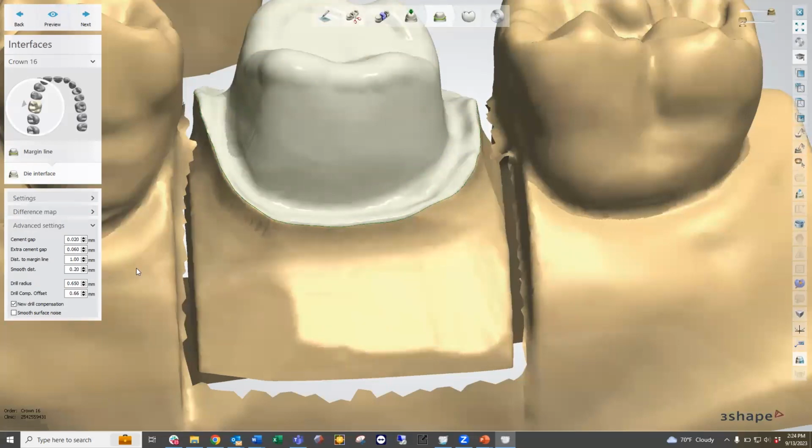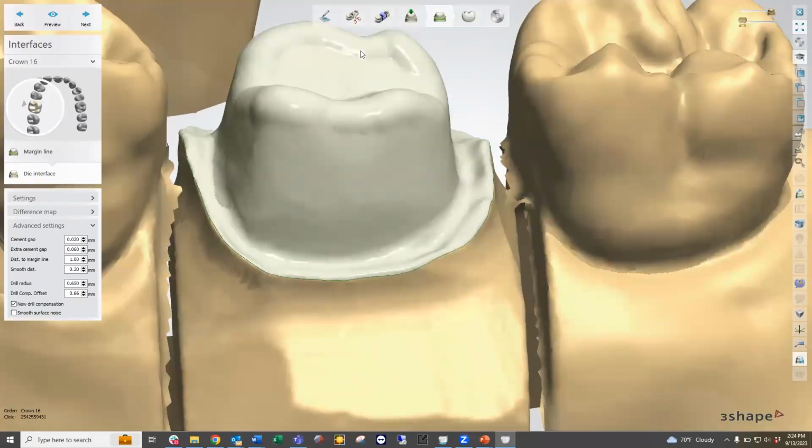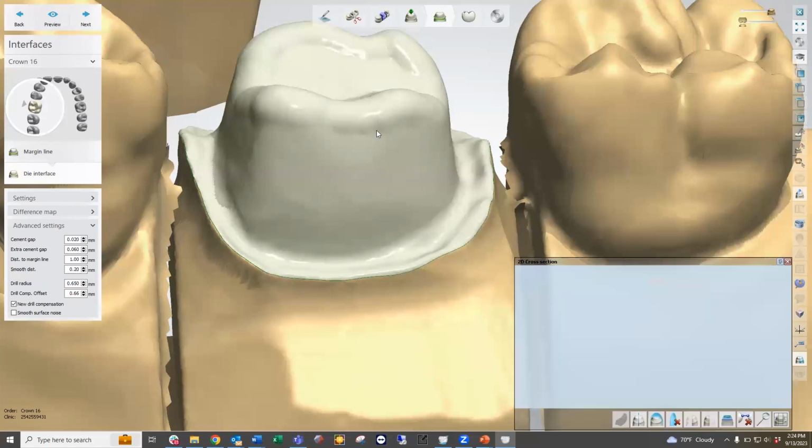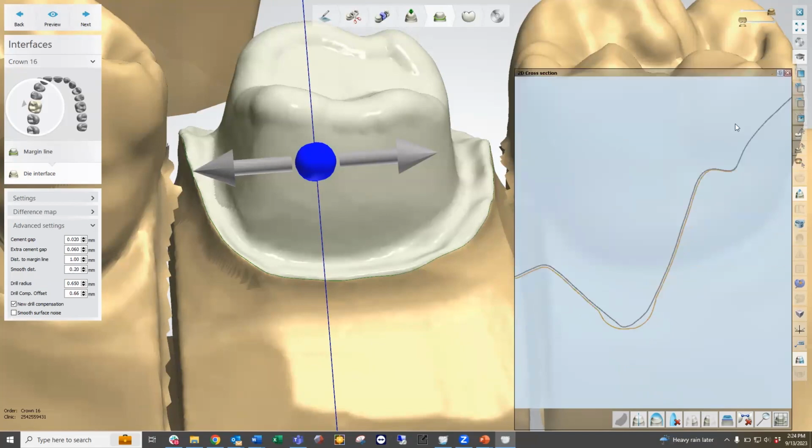So here we have this one set up for drill compensation, which we see as a bubble around these sharp areas. That's basically extra burr or drill depth in those areas to compensate for those sharp edges that we see around the unit. Now I'm going to do a 2D cross section over here and zoom in on this case to show you exactly what we're talking about.